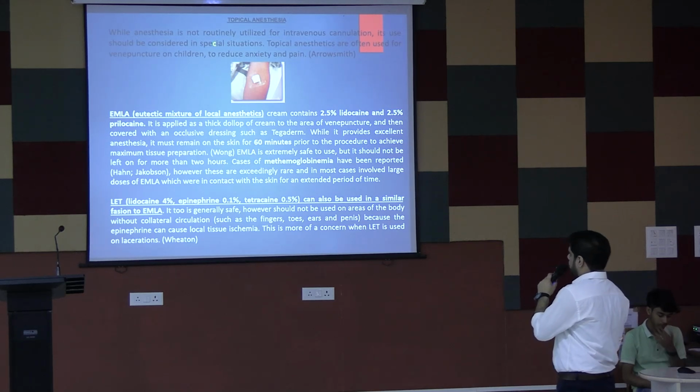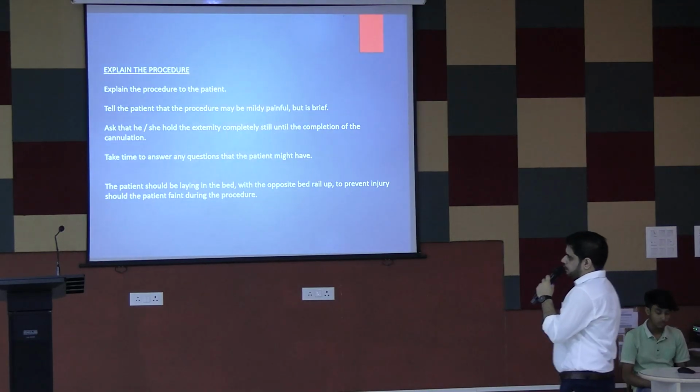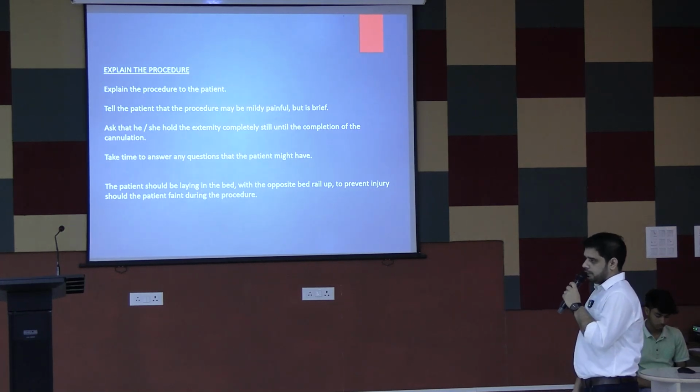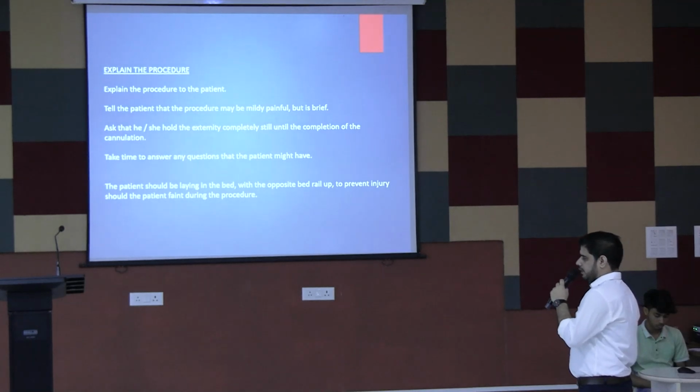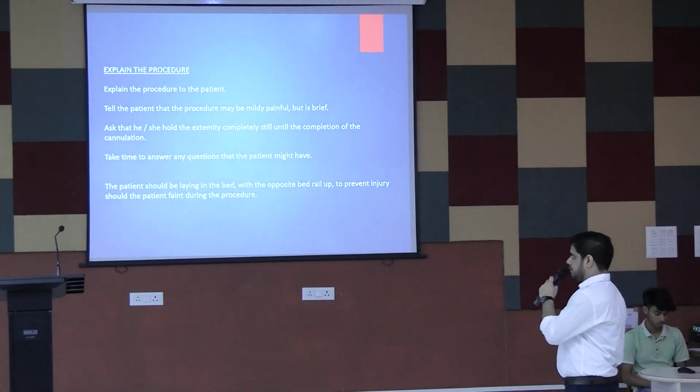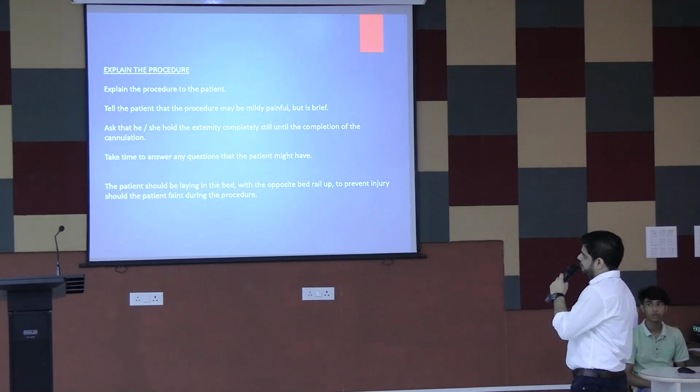Explain the procedure. Before doing every procedure, we should first explain to the patient about the procedure in detail, then the procedure should be done.